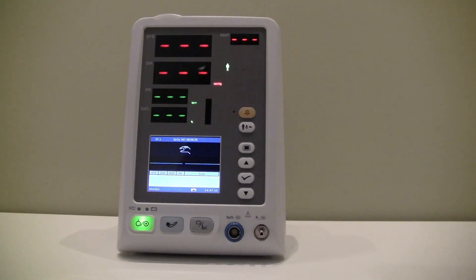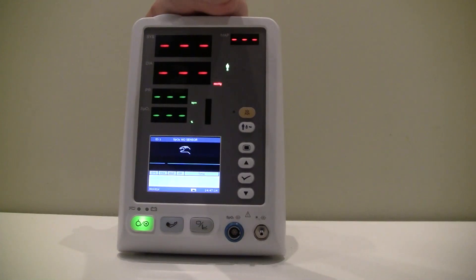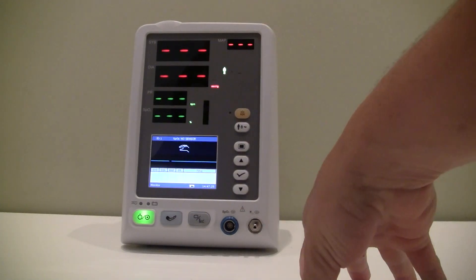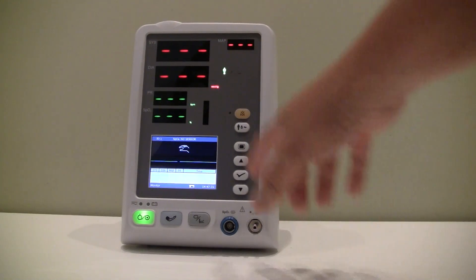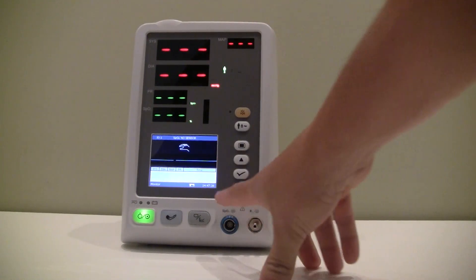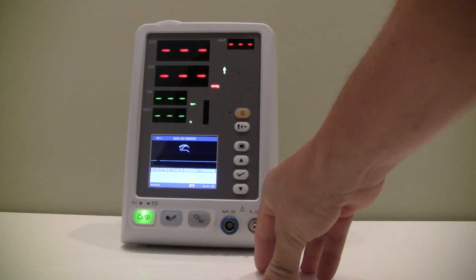Here we have the Eden M3A Vital Signs Monitor. This particular configuration is an SPO2 and NIBP only configuration, though it is available with temperature. It has numeric displays up top showing patient type — adult, pediatric, or neonatal — systolic, diastolic, pulse rate, and SPO2, along with a three-and-a-half inch LCD display at the bottom of the screen.